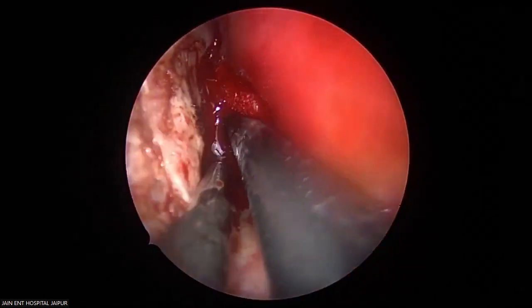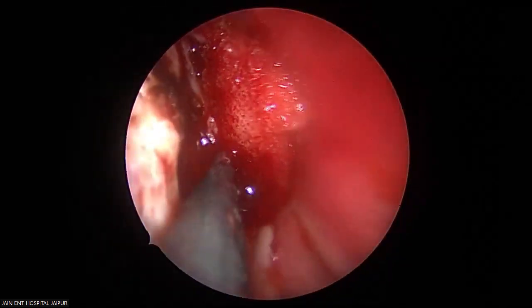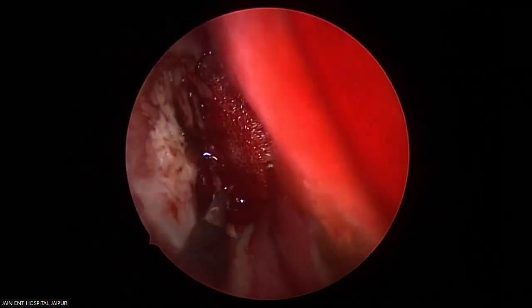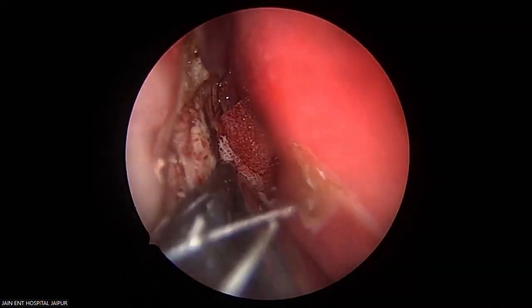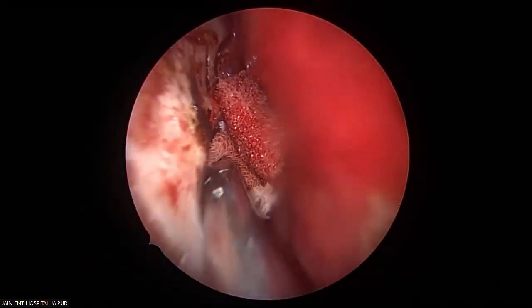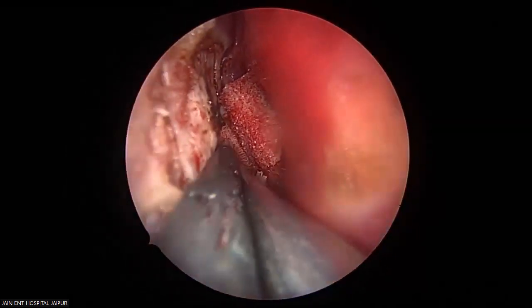Section. Like this. Small pack. So now, this part I can leave here for a while. See this? My medial wall exposure is good now. Yeah, we'll almost go complete, further behind as we remove till here.